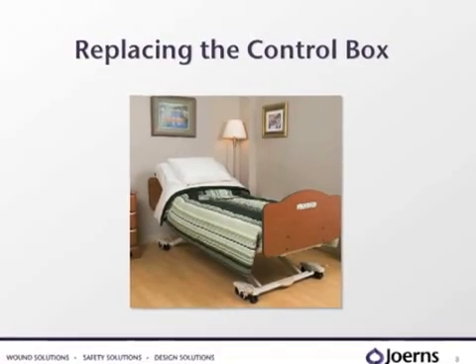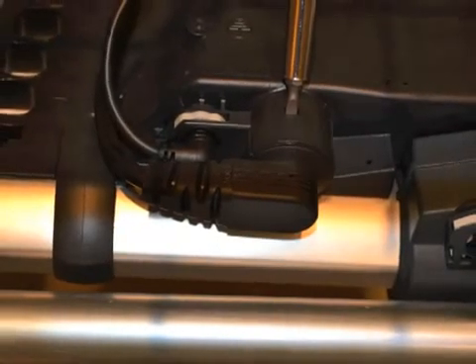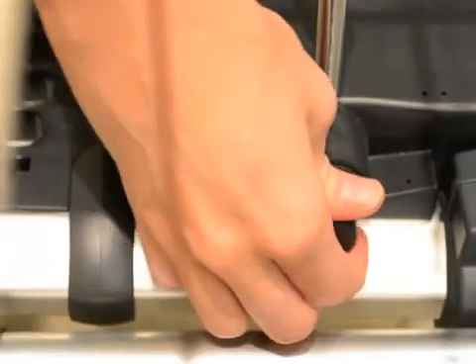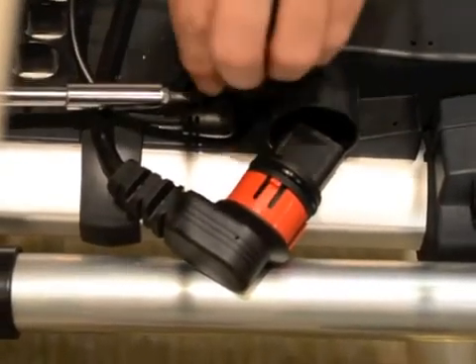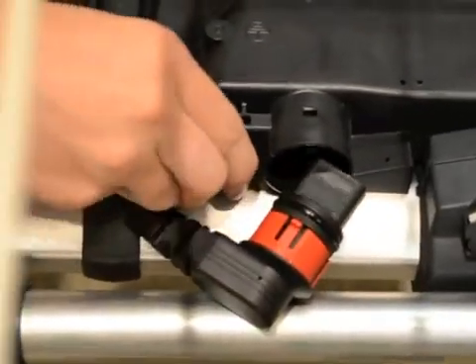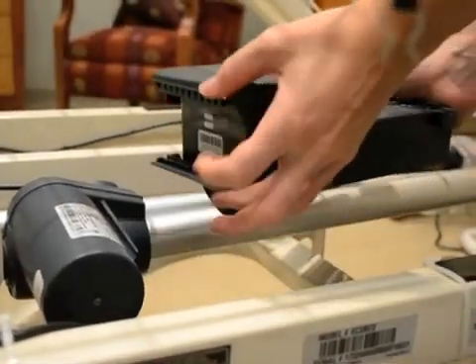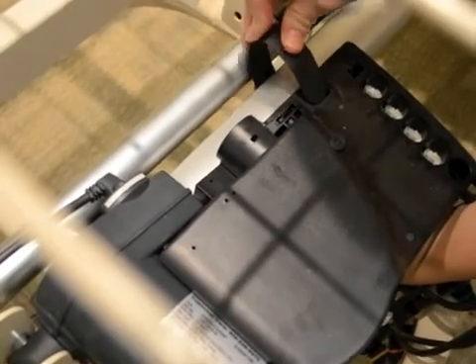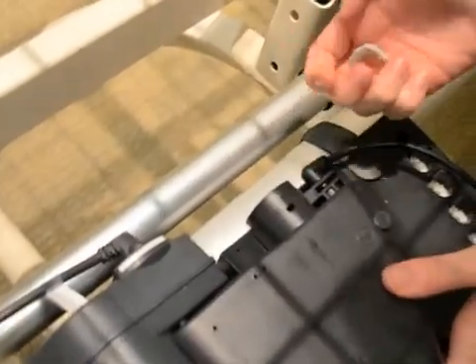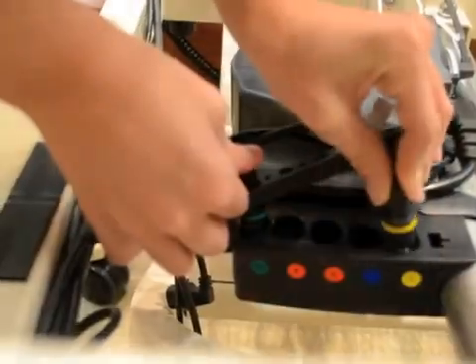To replace the control box, you will need to disconnect all 4 motors, control harness, battery cable, and AC power cord. To disconnect the battery cable, use a screwdriver to push down on the red tab and pull out on the cord to release the tabs. To remove the auxiliary battery cable, pop the C-clip up using a screwdriver and unplug the cable. Then, remove the C-clip from the motor and slide the control box off of the motor. When it's time to reinstall the control box, simply slide it back on the frame and secure the C-clip to the motor. Begin by plugging in the battery cable and secure it with the smaller C-clip. Then plug in the AC power cord and all 4 motors into the control box.